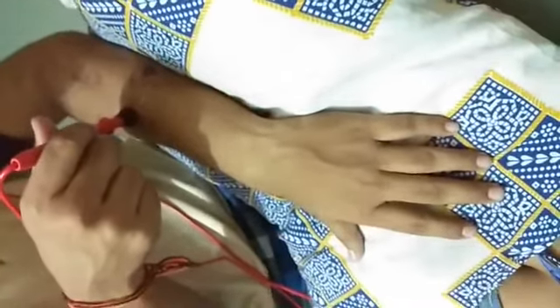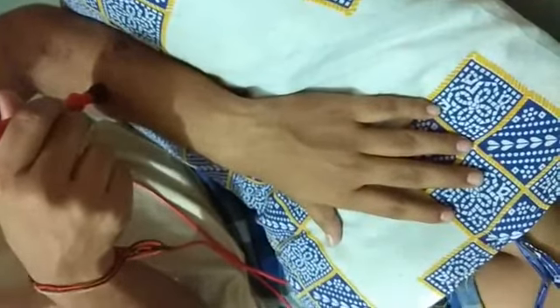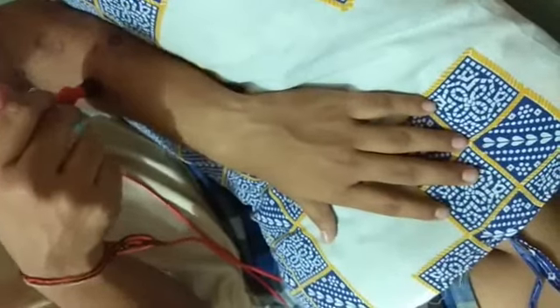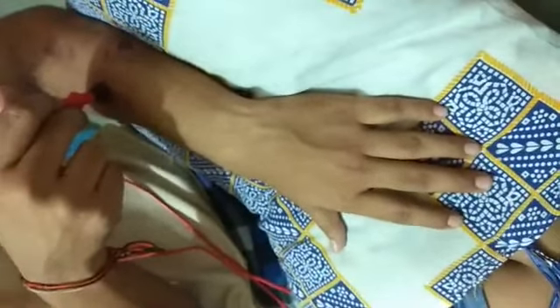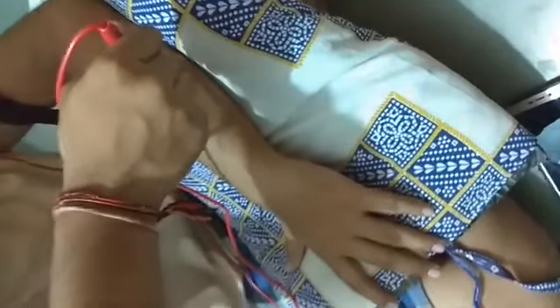This is the motor point for the extensor indicis muscle. The action of extensor indicis is extension of the index finger. This is the motor point for the extensor digiti minimi. The action of extensor digiti minimi is extension of the little finger.